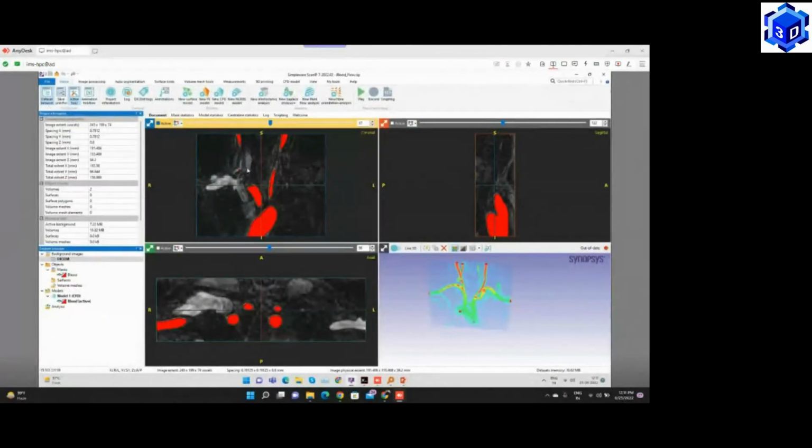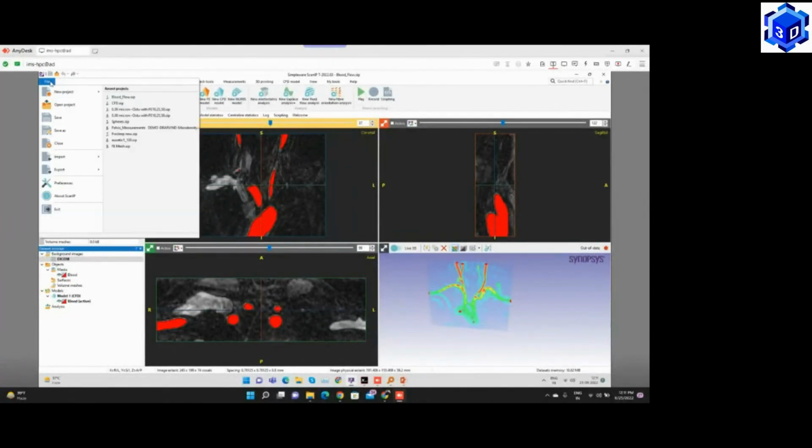So this is basically the GUI of the software. If you want to import the DICOM images, you have to use this import button. You have the option to import medical images, which are basically DICOM images, and industrial images. You can also directly import basic image formats like JPEG, PNG, RAW, etc. And you can also directly import 3D models. STL is the universal format for 3D printing, or if you're working in the 3D domain, so you can directly import STL files.